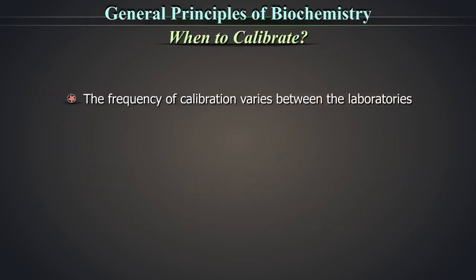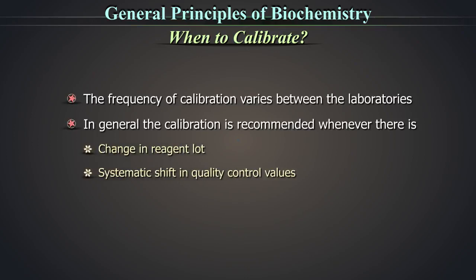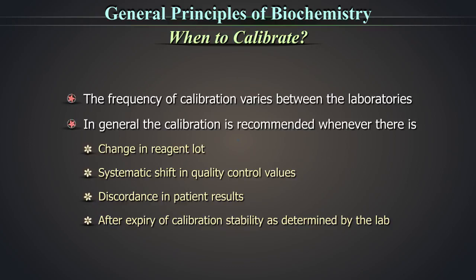When to calibrate? The frequency of calibration varies between laboratories. In general, the calibration is recommended when there is a change in the reagent lot, a systematic shift in quality control values, discordance in patient's results, or after expiry of calibration stability as determined by that lab.